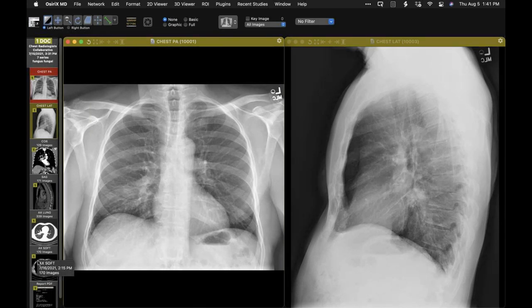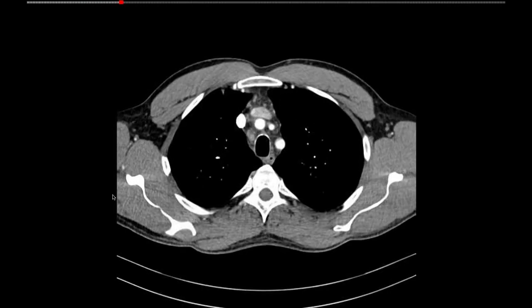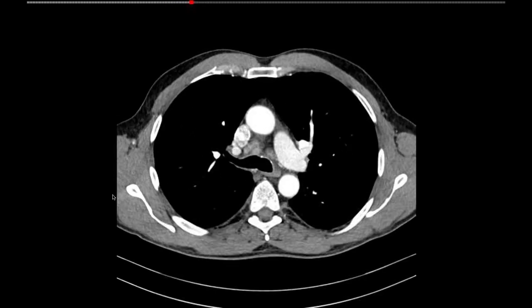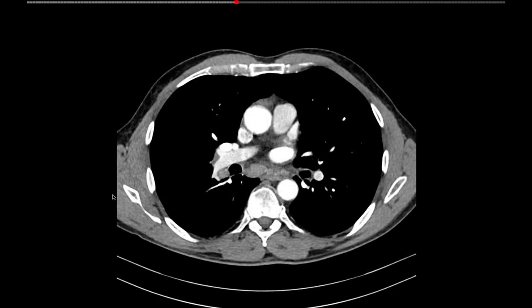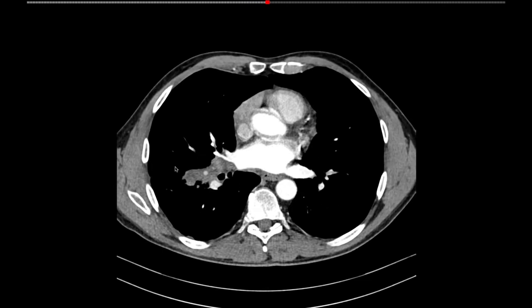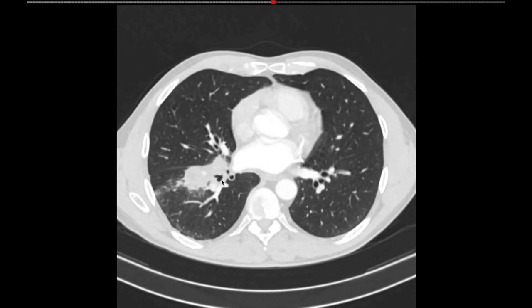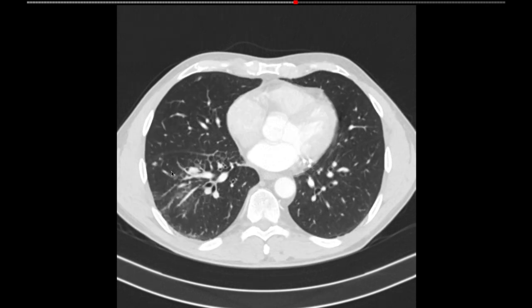So let me show you the CT. And you will see already that there is substantial lymph node enlargement, even in the paratracheal region, and a fair amount there, and more of the same in relation to subcarinal lymph nodes, but also in relation to intrapulmonary lymphoid tissue there. Now we see the lymph node enlargement, but now the pulmonary abnormality. So extensive regional lymph node enlargement, and that is the pulmonary abnormality. And you can see its relationship to the pulmonary vessels there. And indeed, yes, there are septal lines and peribronchial fluid cuffs and small nodules.